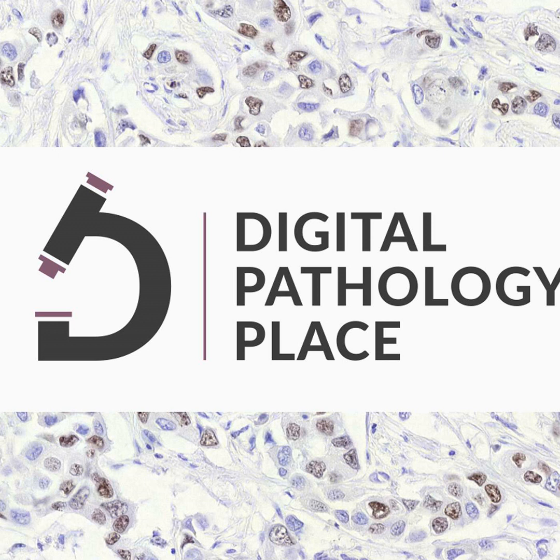When a deep learning model, for instance, identifies malignant cells within a tissue slide, it's important for the pathologist to understand why and how the model came to that conclusion. Was it the shape of the cells, their clustering pattern, color variation, or some other feature that led the model to its conclusion? With XAI, these questions can be addressed, offering pathologists more comprehensive understanding of the algorithm's diagnostic process.